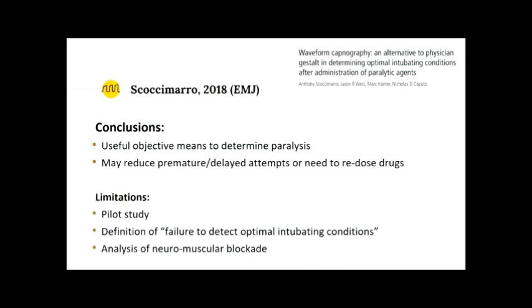There are definite limitations. So, of course, it's a pilot study. They don't have high numbers. They're not powered. I have a challenge understanding their definition of failure to detect optimal intubating conditions. We're using a capnographic definition despite it not being validated. So they're trying to study it, but they're using it as their standard as well. So it was very challenging to wrap my head around that. And they commented they weren't able to analyze whether they achieved neuromuscular blockade at the same rate between the two groups.